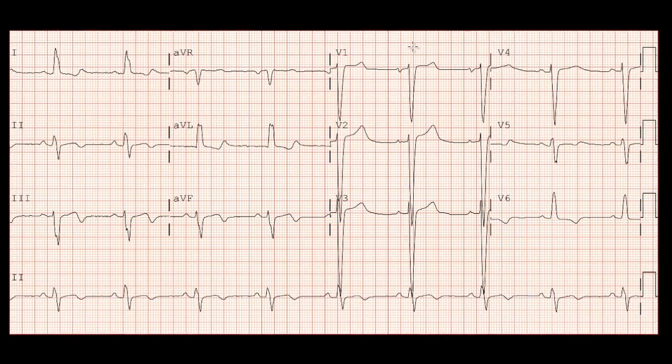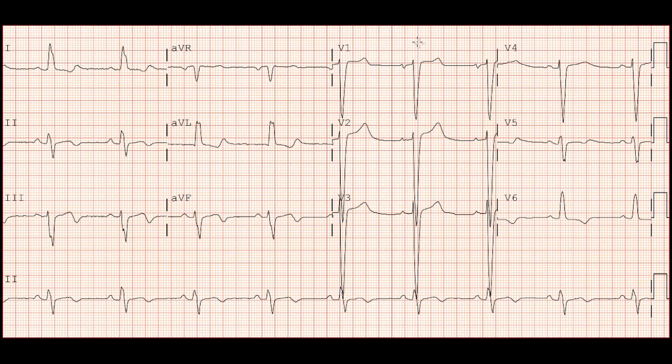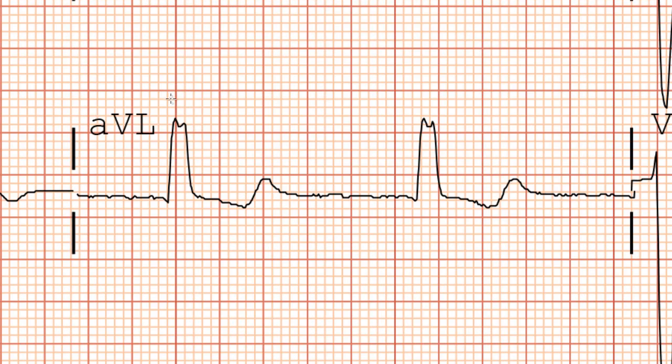Let's try it on another one. So this tracing you can see is also pretty regular. You've got a similar amount of space between each consecutive QRS complex, so we can use our box method. So let's go ahead and find a QRS complex that's on the line. This one looks like it's about on the line, and we'll just count off 300, 150, 100, 75, 60, 50. So we can see here our QRS complexes somewhere between 60 and 50, so I'll go ahead and say our heart rate here is about 55 beats per minute.